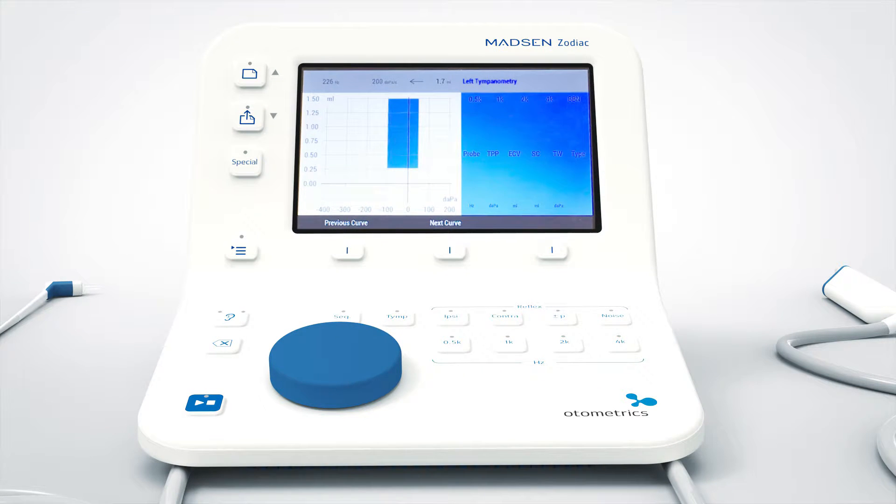In this case, I want to perform a manual tympanometry test. Manual tympanometry is a special test. To reach this in the diagnostic or clinical version, you just have to press this button called Special.